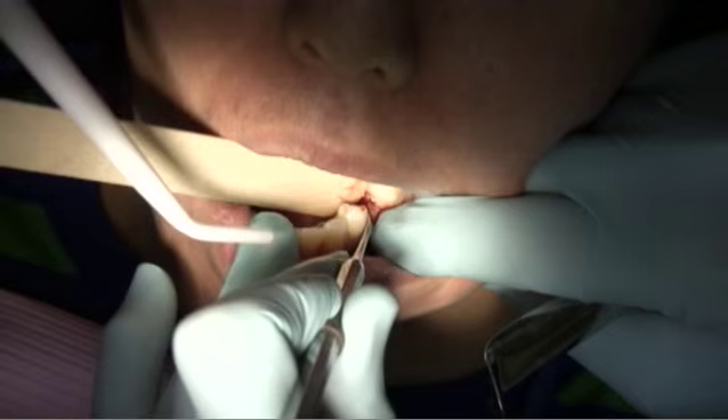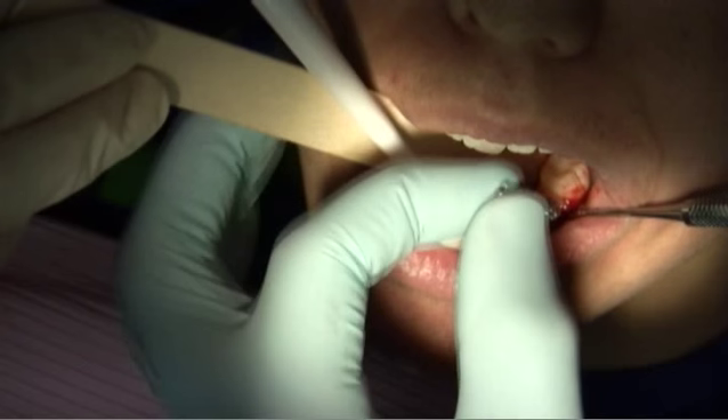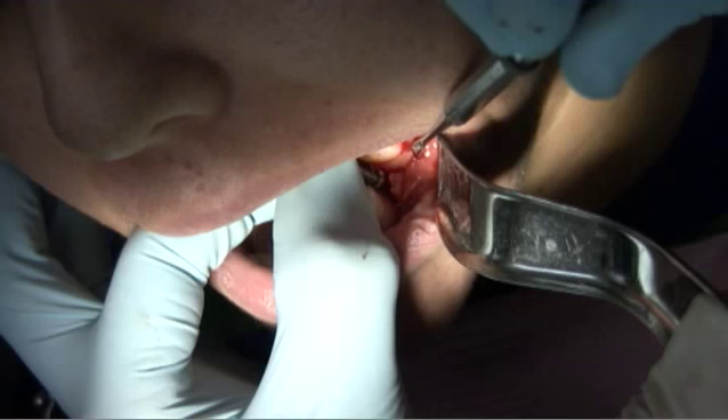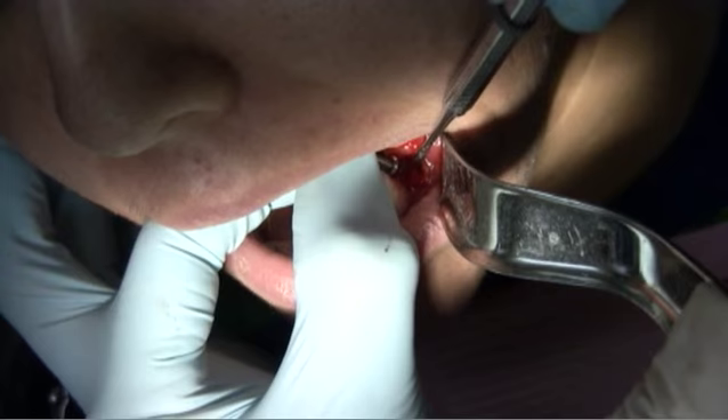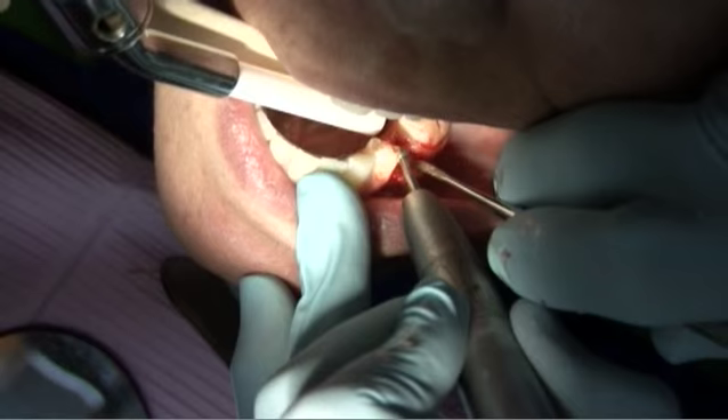To evaluate this relationship, rotate the collar on the gauge to the base and place it on the crest. Here it is determined that recontouring of the ridge is required. Without ridge contouring, the platform on which the crown margin is established will be too coronal. A large round diamond from Brassler with water spray is used for this modification.